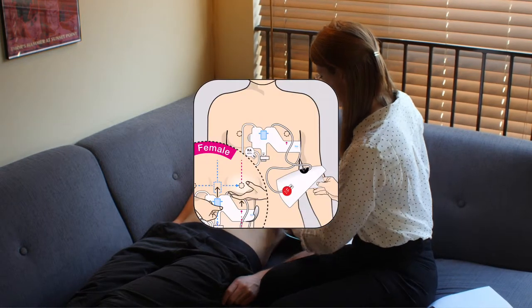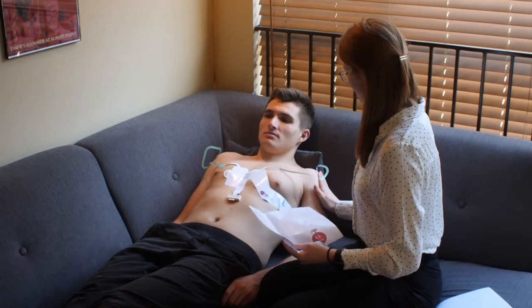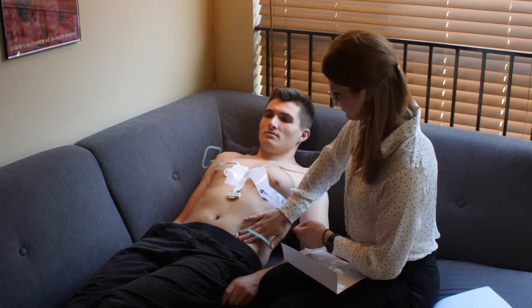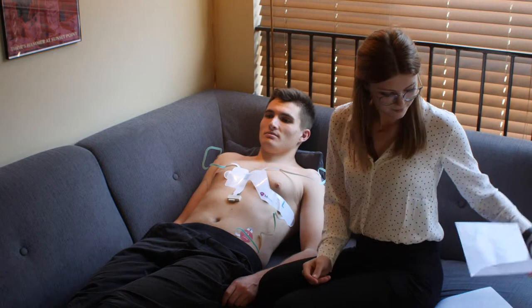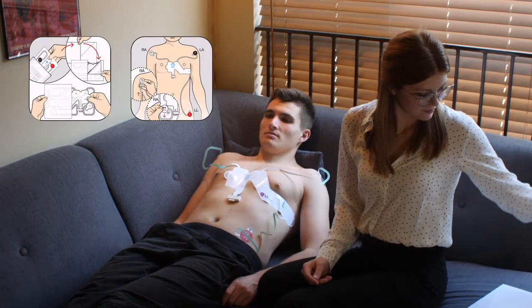For females, it may be necessary to lift up the left breast while positioning the electrode strip. This arrow should be pointing at the patient's left nipple. Pull the electrode labeled LA to the patient's left shoulder and LL to the patient's left lower belly. The electrode strip can even be applied by patients to themselves. Please refer to the video titled Applying the electrode strip to yourself for further instruction on this.